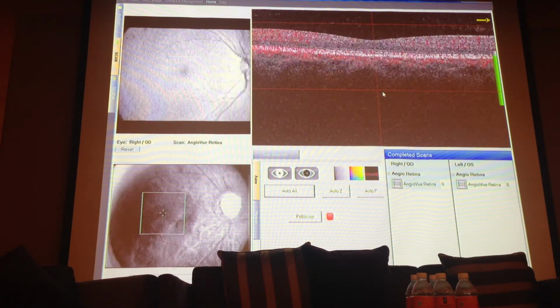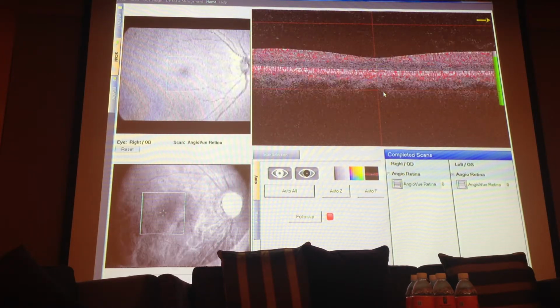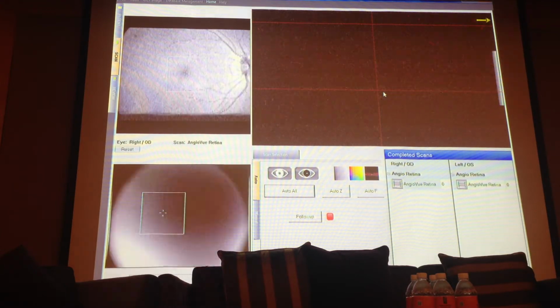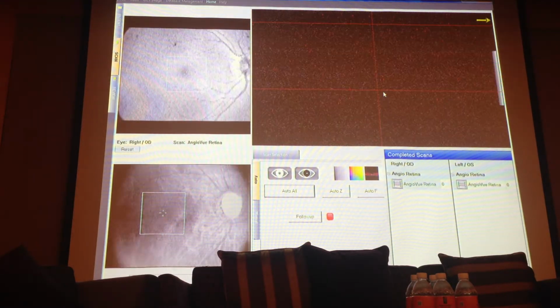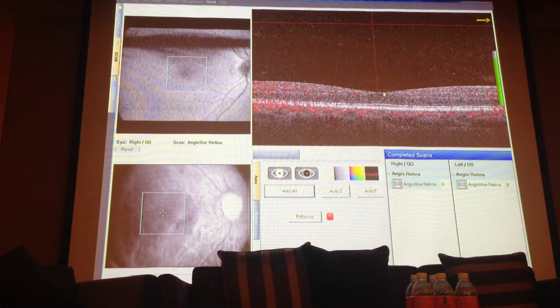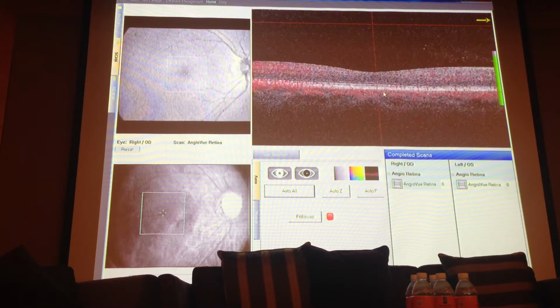Inside, yeah, just like this. You can push forward or backward to make it happen, or you can change the depth by scrolling the wheel. Like a single click in the B scan window, you can scroll the mouse wheel, and you can adjust the depth of the position of the retina.